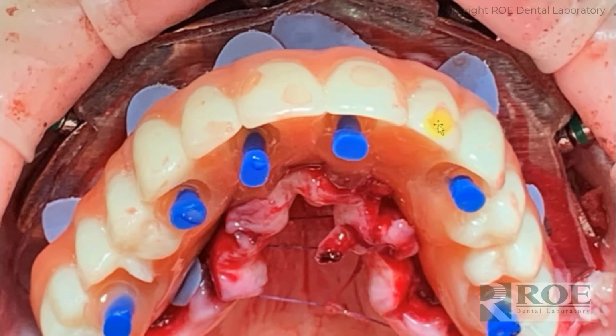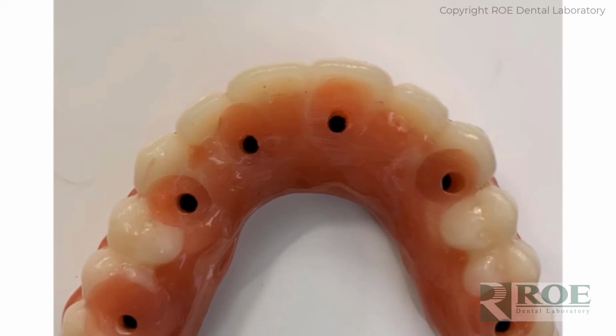They are used to block out the temp cylinders, to block out the MUAs. And then the prosthetic goes on, and then the blue plugs to block out the temp cylinder openings, and then you just simply backfill around the holes, inside the holes, to pick up the temporary cylinders.